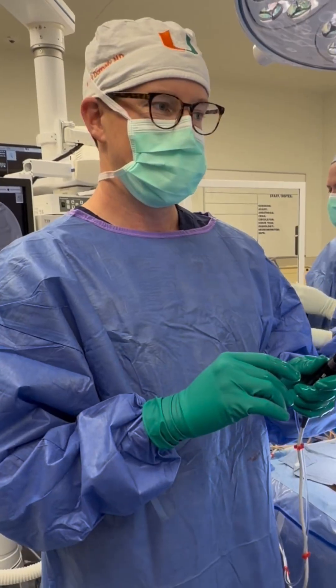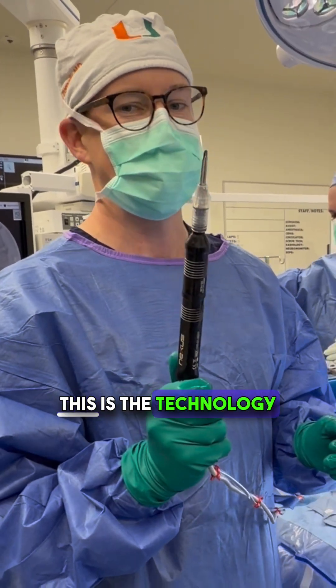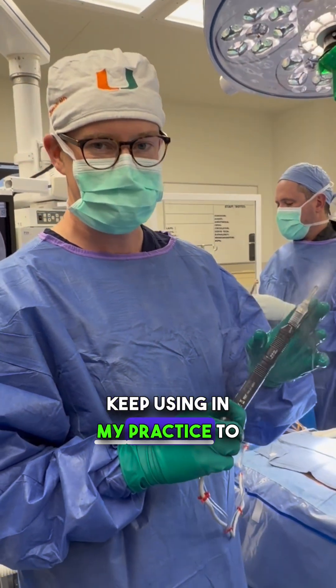The burr that spins around is a great tool — it's a dangerous tool, but it's still a great tool I use all the time. This is the technology that I'm going to keep using in my practice to help my patients.